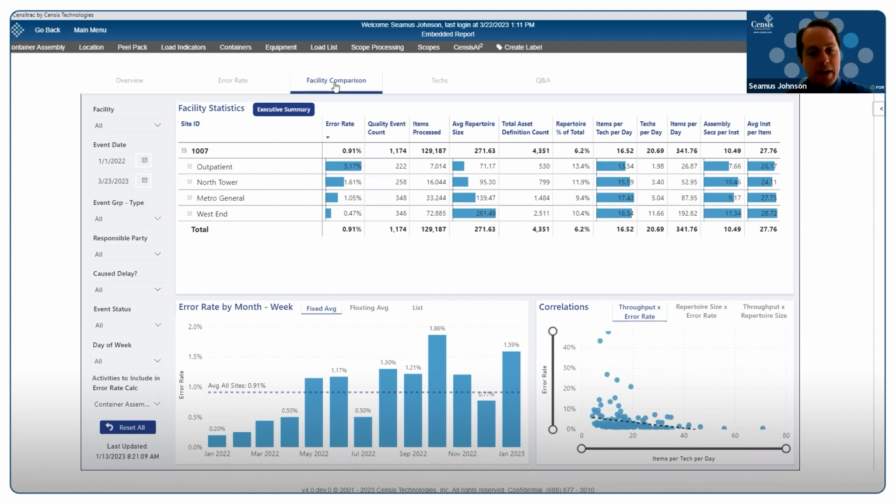And a department that has a high throughput rarely has a lot of trays stacked up waiting to be processed. And so technicians rush a lot less, quality improves. We see that pattern across every facility that we look at.